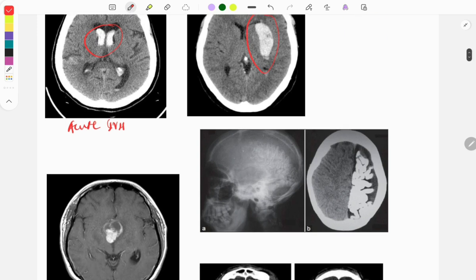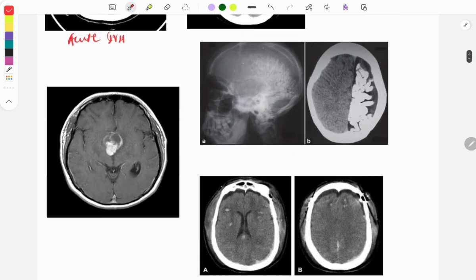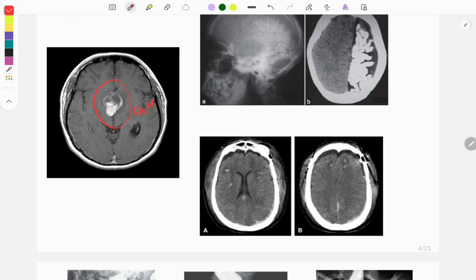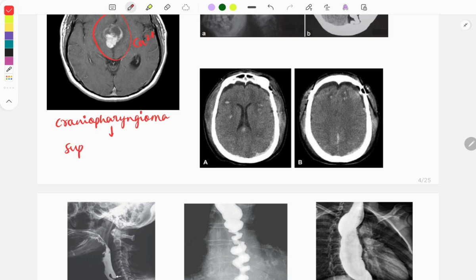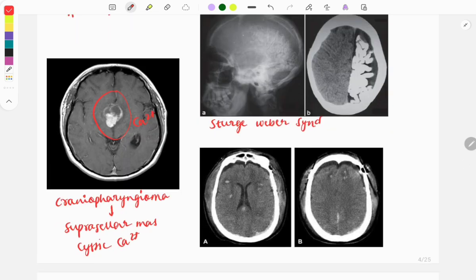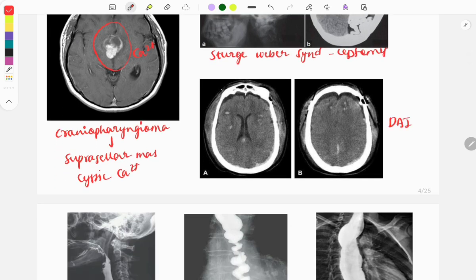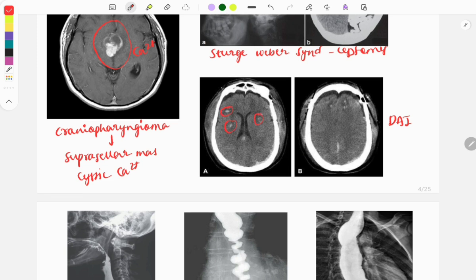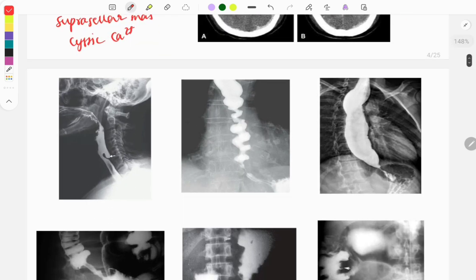In parenchymal bleed, bleeding occurs in the brain parenchyma; the most common cause is hypertension and the most common location is the putamen — both are asked as one-liners. The next image shows calcification due to craniopharyngioma: it is a suprasellar mass with cystic calcification. Another image shows leptomeningeal involvement seen in Sturge-Weber syndrome. Diffuse axonal injury presents with multiple white petechiae on imaging.